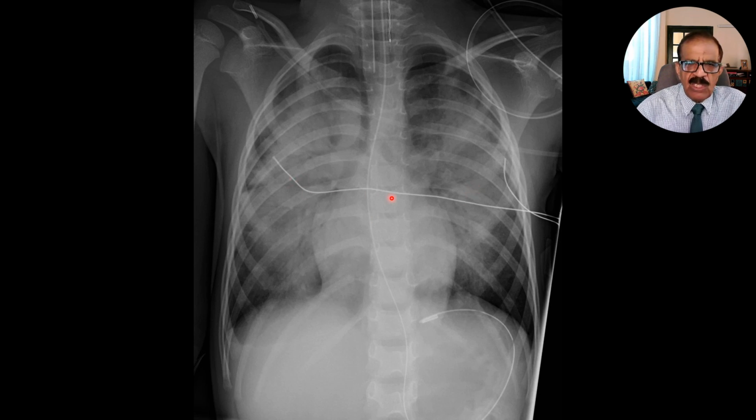As you can see, these lines and catheters and electrodes, this patient must be very sick, and there is perhaps an endotracheal tube also. Maybe this is a case of COVID pneumonia, but the appearance is very much similar to pulmonary edema. That is why this X-ray is included here. So you need to differentiate cardiac pulmonary edema from non-cardiac pulmonary edema.